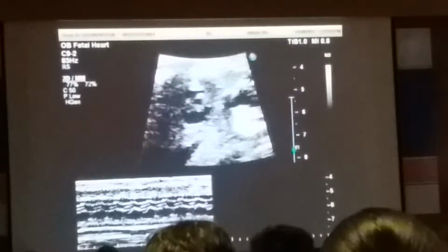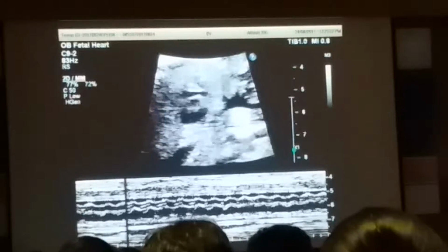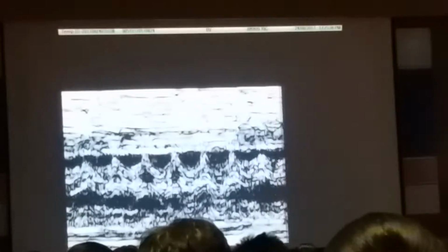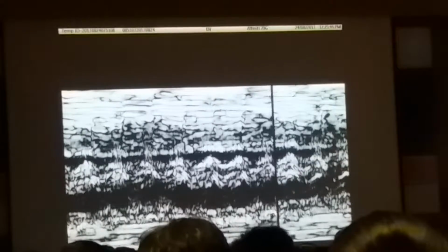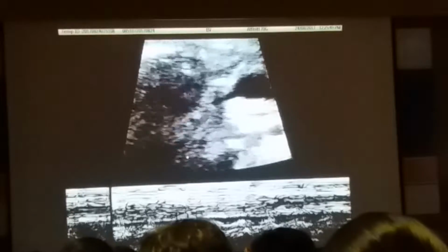Okay, there's the box in the middle. Now we can't make that any bigger. There's no way I can make that fill the whole screen. Yeah, let's do it like that. There we go. Okay, now we want to sweep the speed up quicker. Okay, now I can't see anything. Now I'm just hoping on a prayer. I'm doing M mode like I used to do in 1970, when there was no other image that I could look at. Right, there it is.